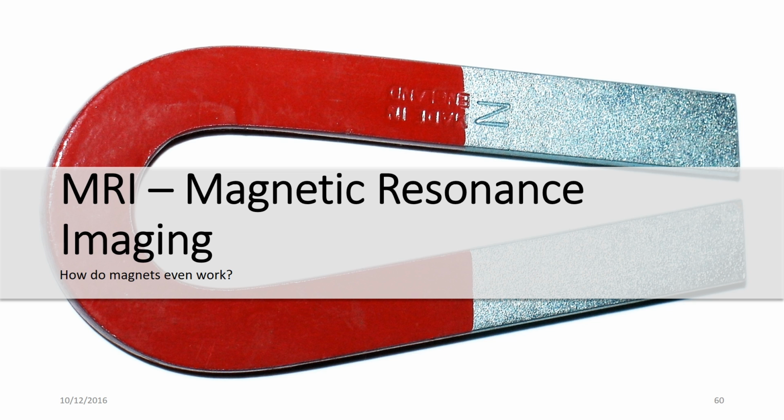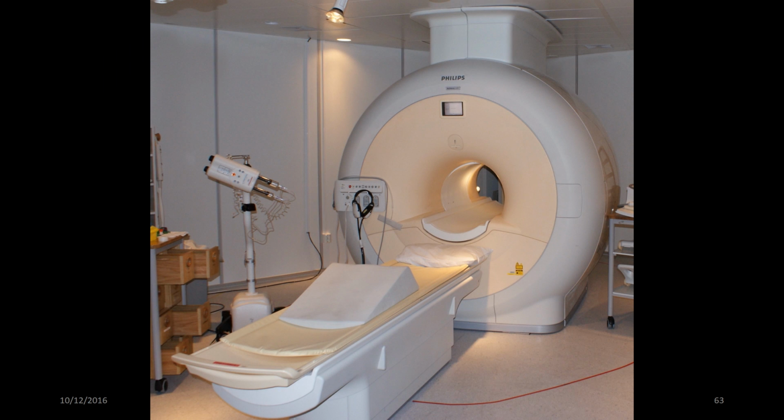Now, they don't look like your typical magnet that's in this background picture here, but your average MRI scanner kind of looks like this. And it is very similar to the electromagnets that we used to make at school. So this is your average MRI scanner. And if you've ever been in one or worked in one, you'll be familiar with what they look like and what they sound like.